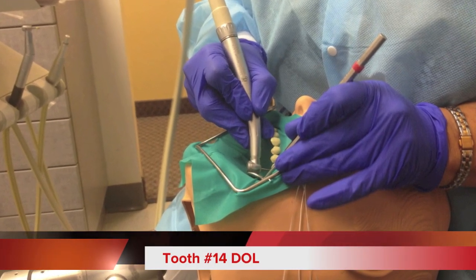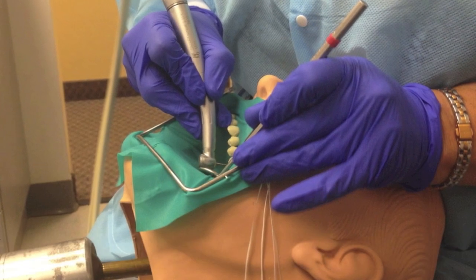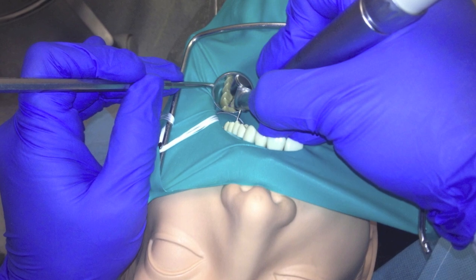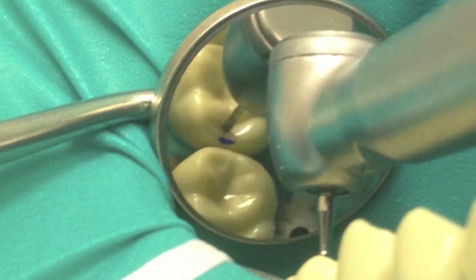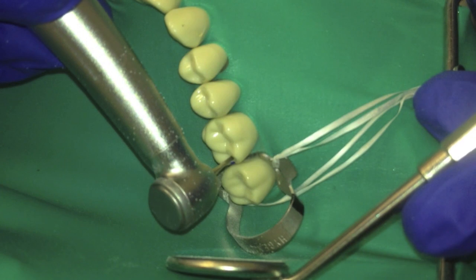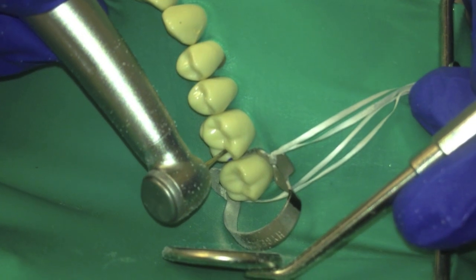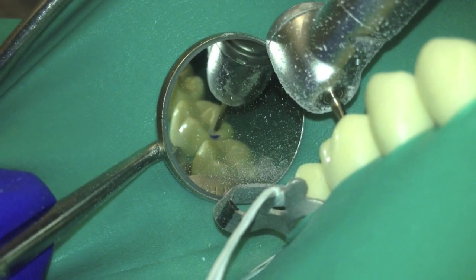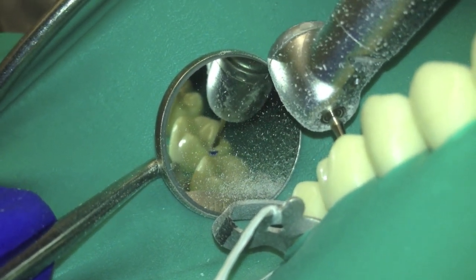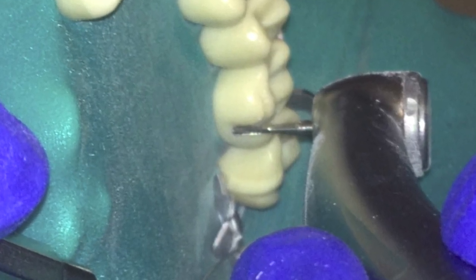When working on the maxillary arch, the dentist position is at 11 o'clock for a right-handed operator. The patient is seated in a supine position. The maxillary arch plane is perpendicular to the floor, and indirect vision is utilized. The DOL preparation will not cross the oblique ridge. Prepare the Class I portion and thin the marginal ridge before cutting the box. The lingual box includes the lingual fissure and is prepared from the lingual approach, with the dentist switching to the 9 o'clock position.